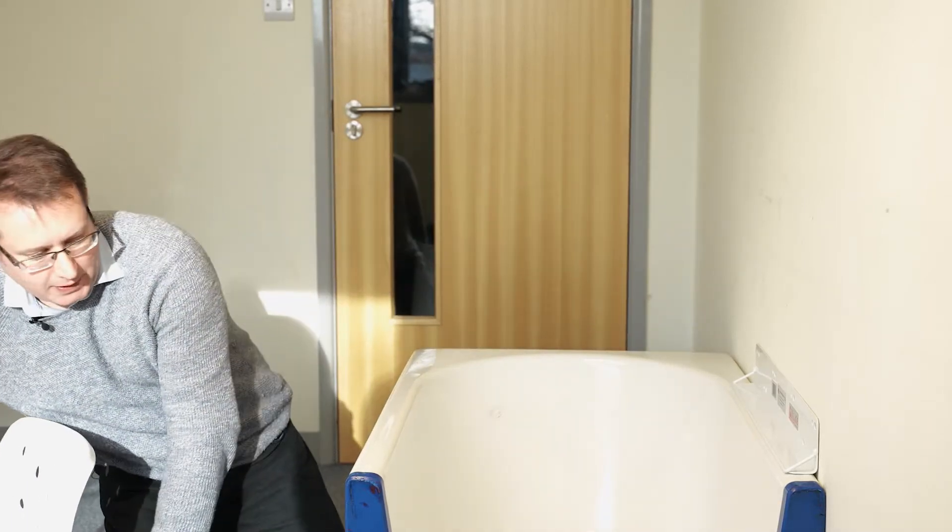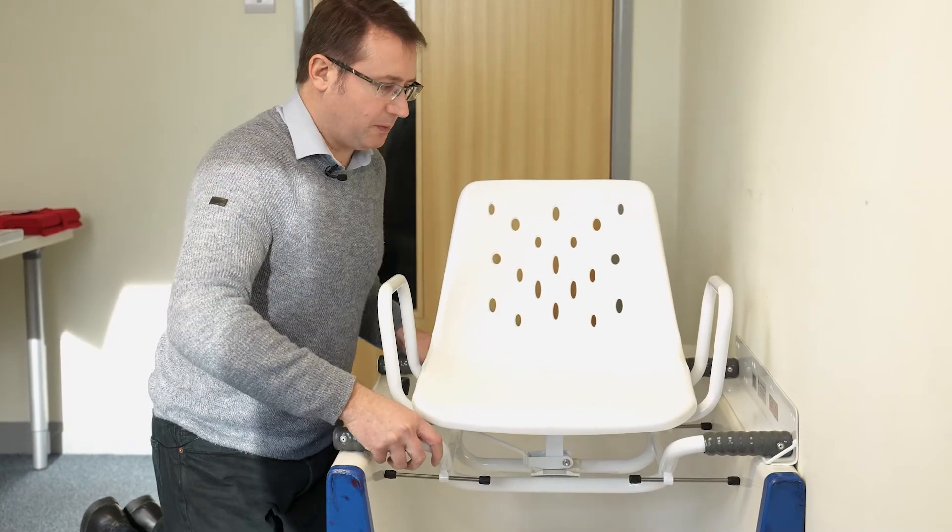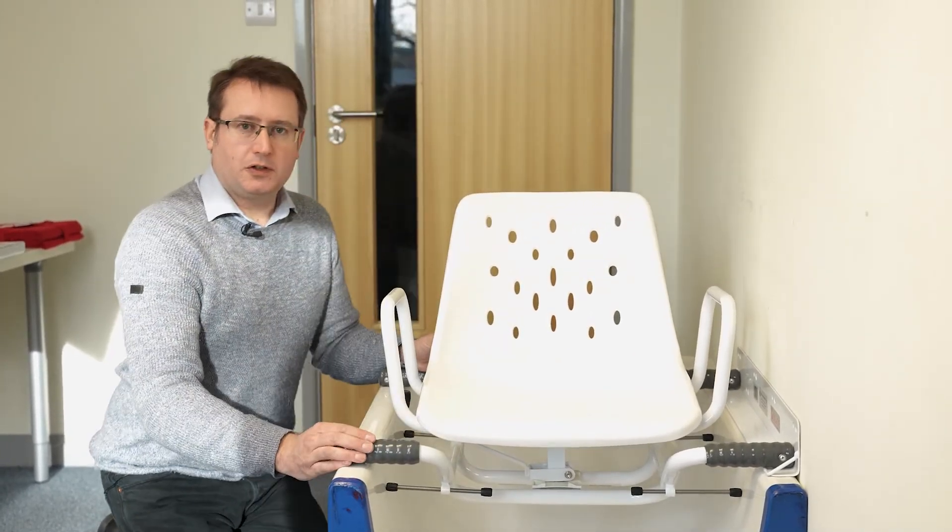If I just put the swivel bather in place, you'll see it's the correct length to accept the frame and will give you a nice secure fitting.